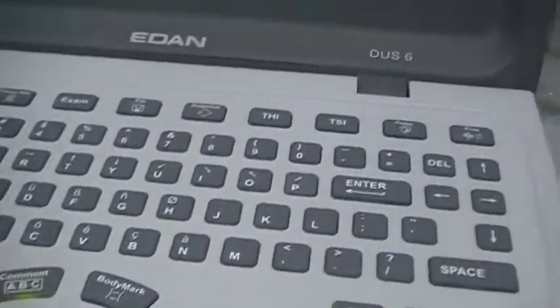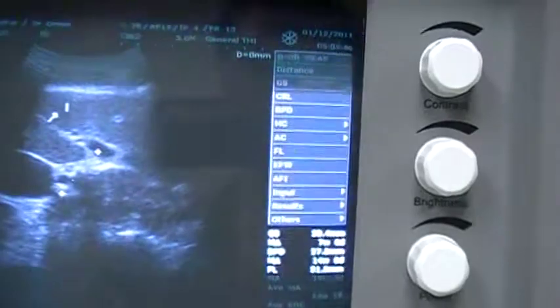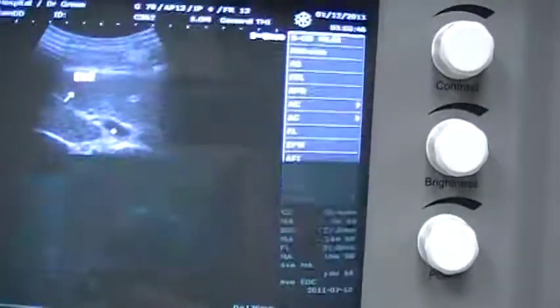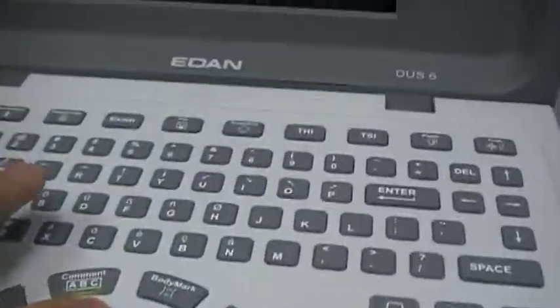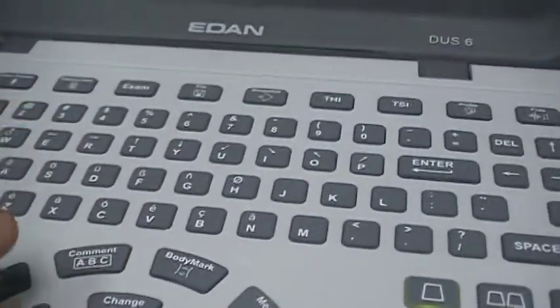After the measurement, if you find something that needs annotation, press the Comments button. Place the comment in the desired area and press Set — then use the arrow keys to position it a little higher or wherever needed. You can input text, and if you want to use the vocabulary list press Change to select a term. When done, press the Comment button again to exit comment mode.